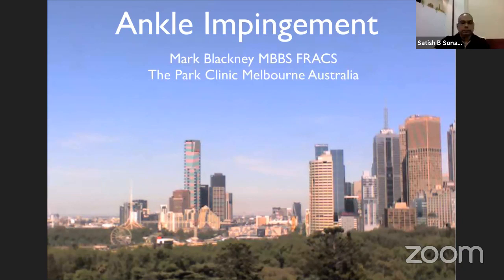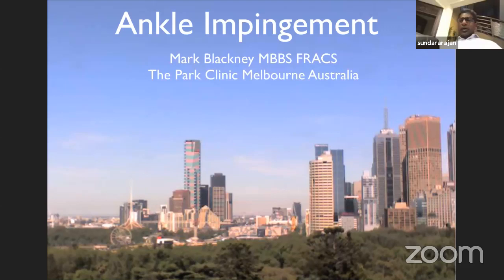It depends upon the diagnosis. How often you require it in a case of synovitis. And when you have arthrofibrosis, you have to go all around the joint, like what you do in the knee joint. But if you have a typical anterolateral impingement or anteromedial impingement, addressing that particular point is more than sufficient because you will not have any lesions in the gutter. So in the two conditions, synovial hypertrophy and arthrofibrosis, you have to go all around the joint and clear, including clearing both gutters.